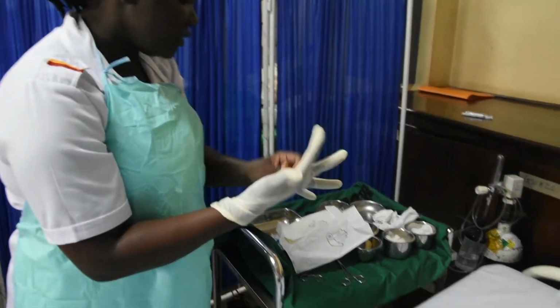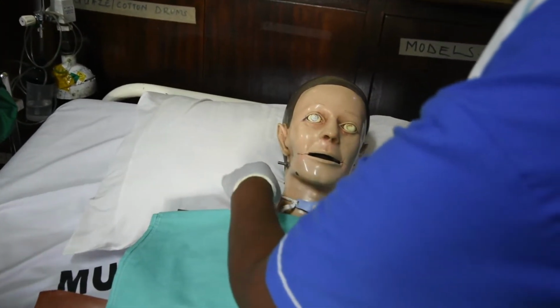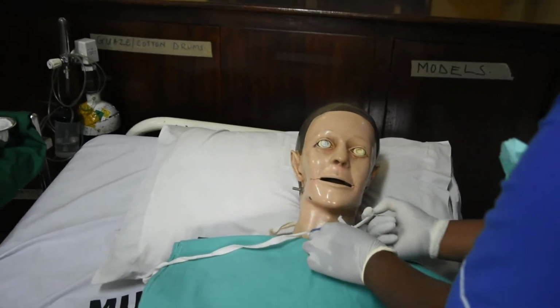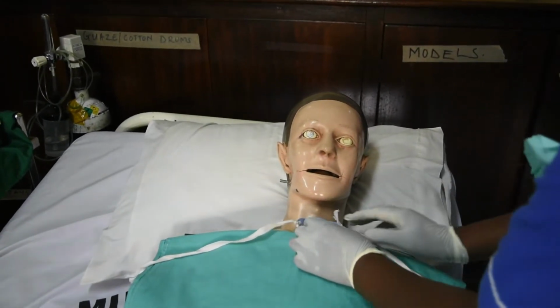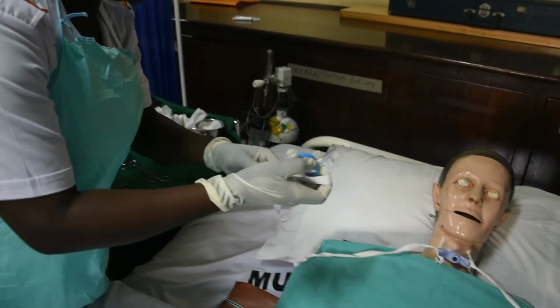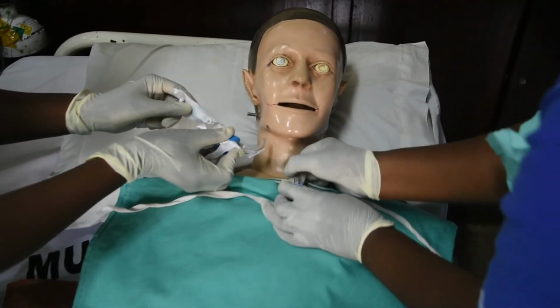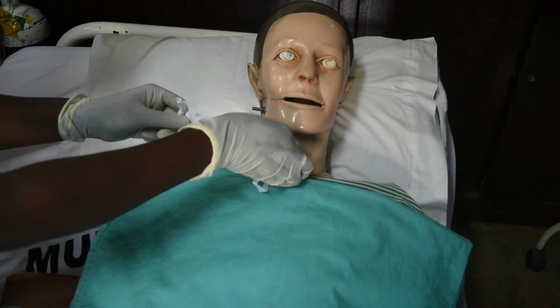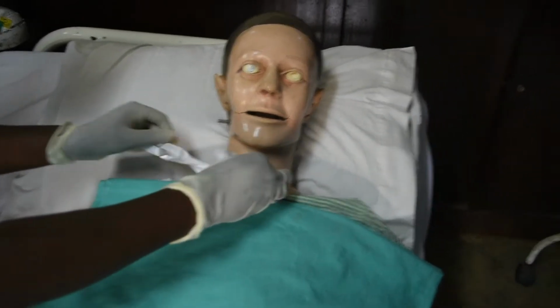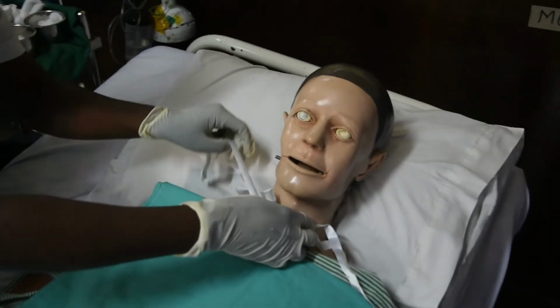So assistant, you're going to help me loosen the strings so that we can introduce a new tracheostomy tube. So after loosening, I make sure I reinsert a tube immediately. Assistant, come and help me tie the strings.